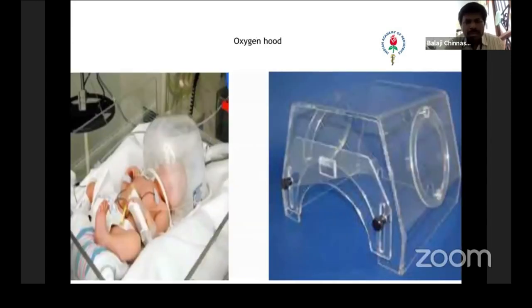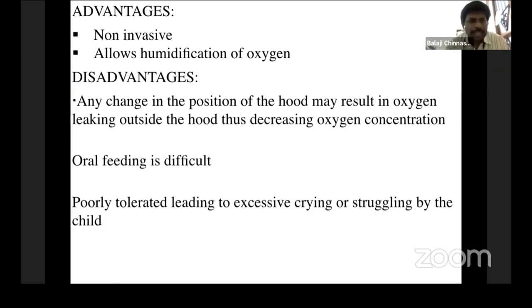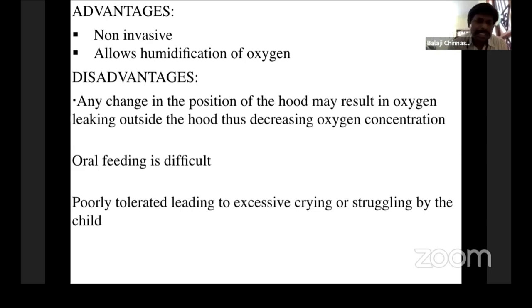In children we also use an oxygen hood — a full box that covers the head, with a provision for the neck and head at the front and an oxygen connection at the back. It is as if the baby is in a different atmosphere full of oxygen. The advantages are that it is non-invasive and allows humidification of oxygen. The disadvantage is that any change in position causes leakage, so oxygen concentration may not be fully delivered. You also cannot feed the baby while inside the hood, so the baby keeps crying and it is poorly tolerated. However, if the baby is sleeping, the hood is the best option.